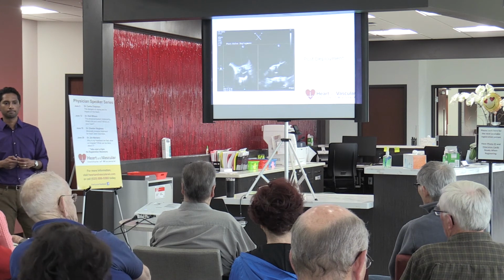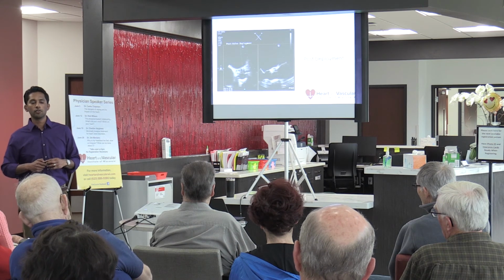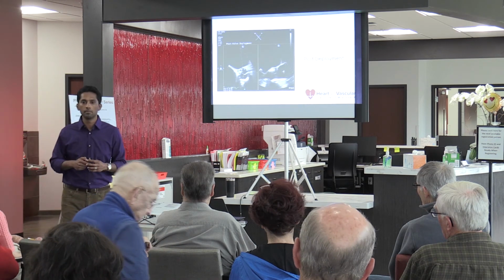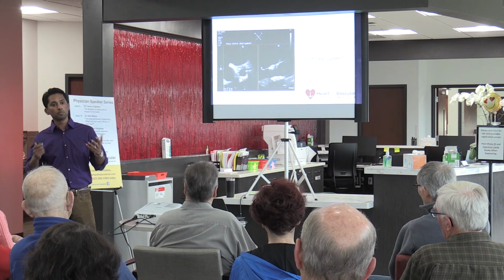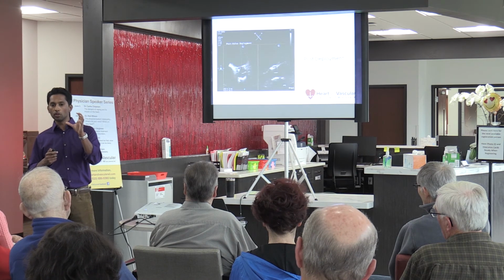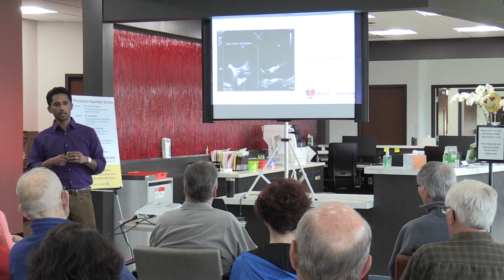If you have a porcine valve, is the outcome about the same? Previous valve? So you're asking if you were to put a TAVR valve inside a porcine valve? Yes. So that's very routinely done, right? And that works quite well. It's actually a very, very simple procedure because you can essentially use the porcine valve or the old bioprosthetic valve as your marker for where the new valve needs to go. And so it basically just anchors itself inside the old bioprosthetic valve.